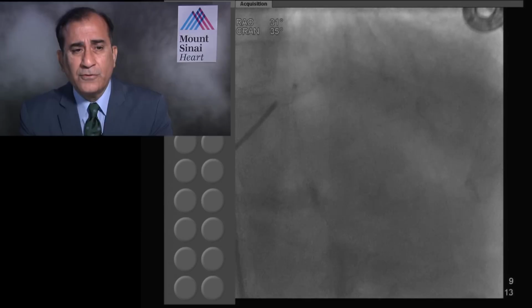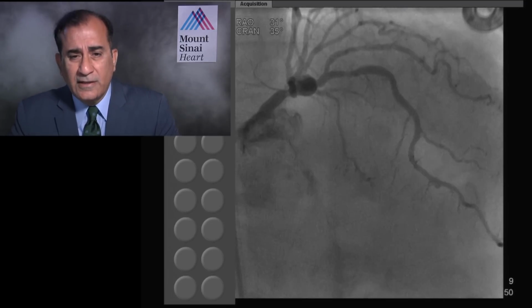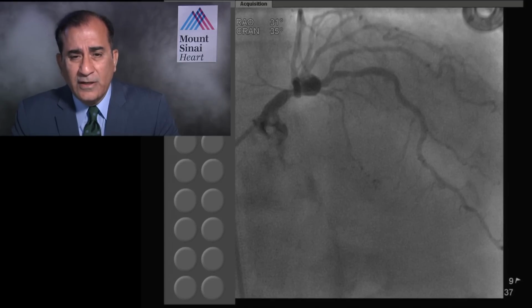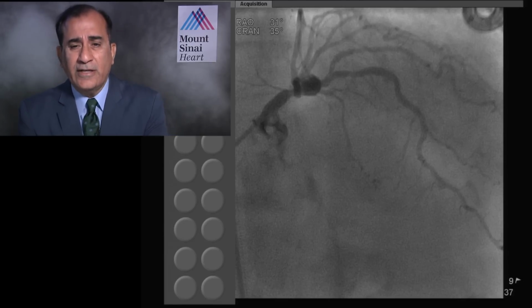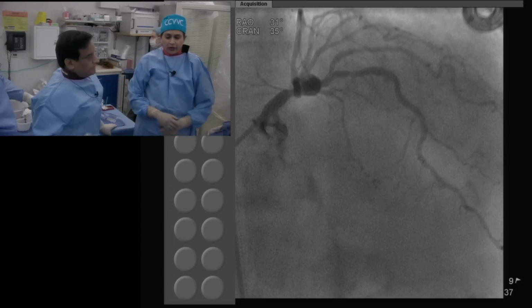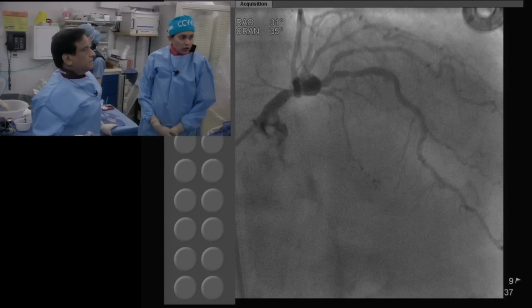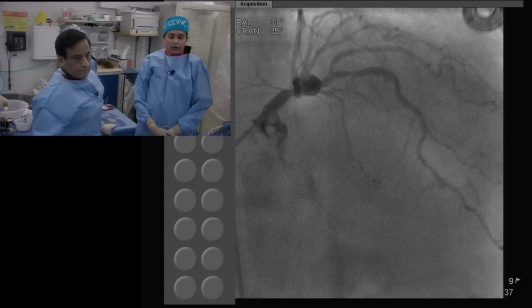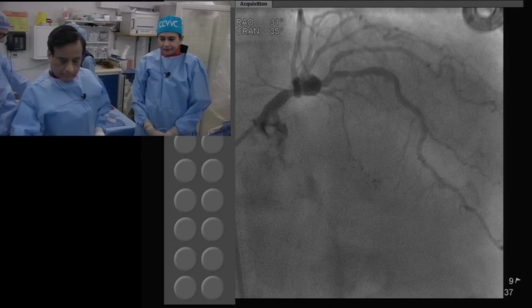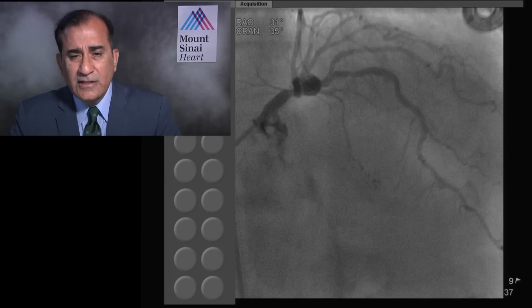So that is the plan. Let's take care of two matters right here. Number one, for most or almost every left main, you will do lesion preparation further. That's correct. And the second part, IVUS should be considered mandatory? Well, though we don't routinely do it, the recommendations are pre and post IVUS, the post definitely for stent optimization of left main. It documents well stent expansion.